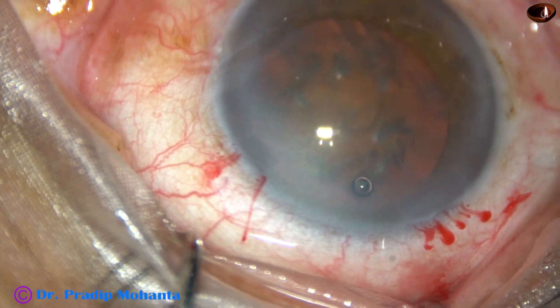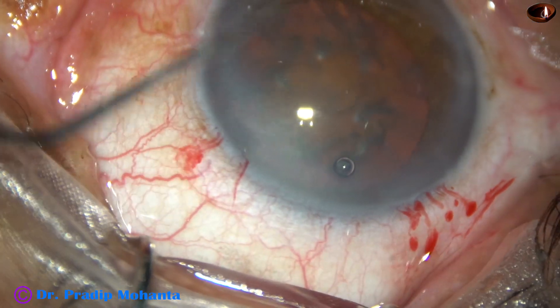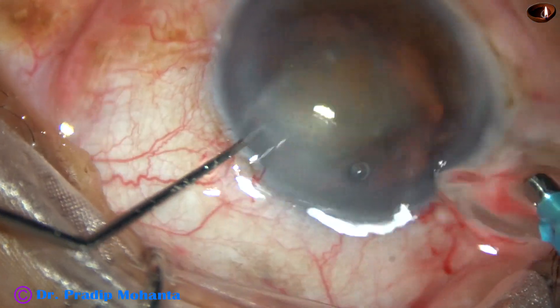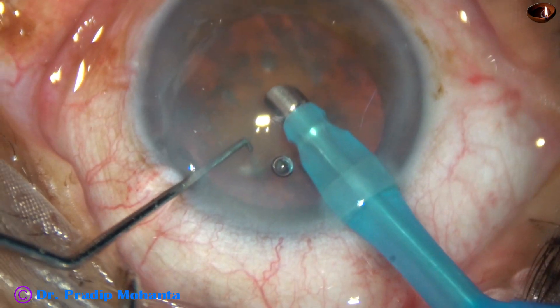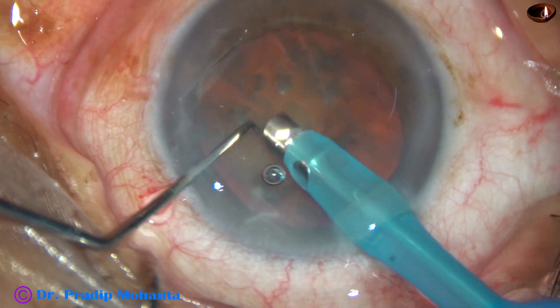The tip of the phaco needle is being introduced into the anterior chamber. And on the left hand is a Sinski-like small chopper designed by me.